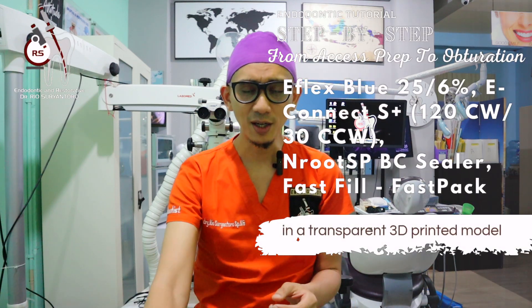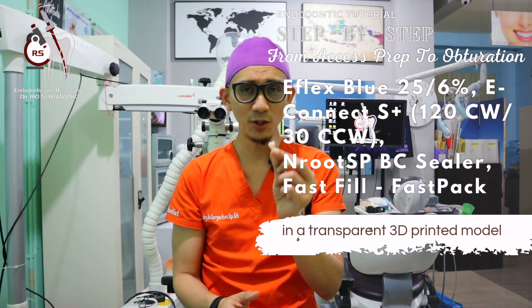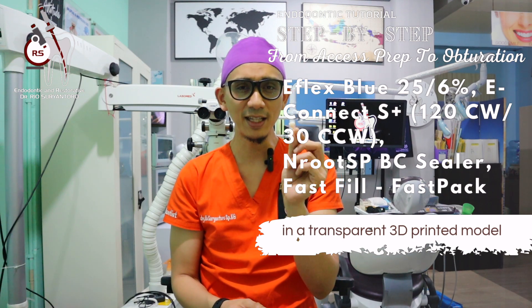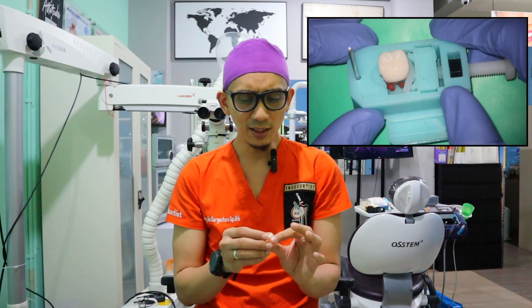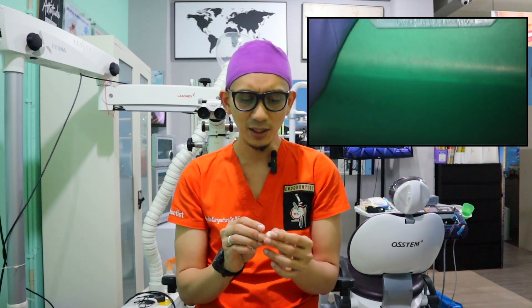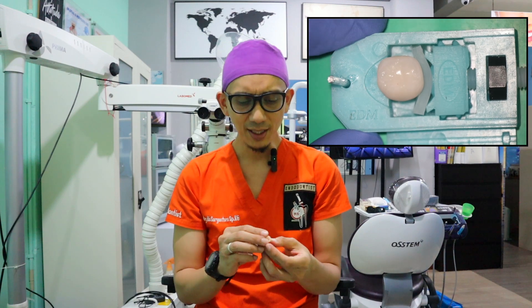Hi, good morning. My name is Rio, I'm an endodontist. I hope that you still love endo like I do, because today I'm going to share with you another tutorial video of doing an endodontic treatment in a molar. It will be done in an endo model manufactured by EDM Dental Practice. This company has manufactured so many tooth models, and this is the newest, the latest tooth model.